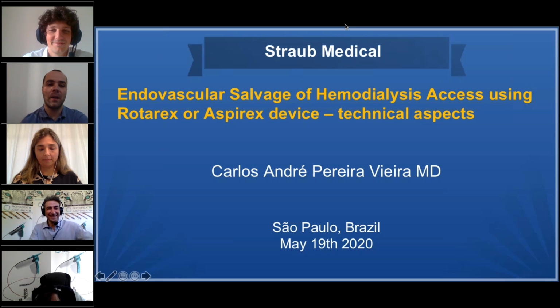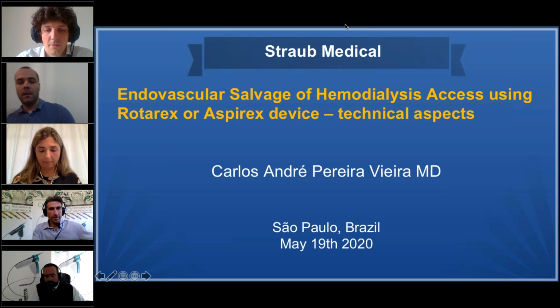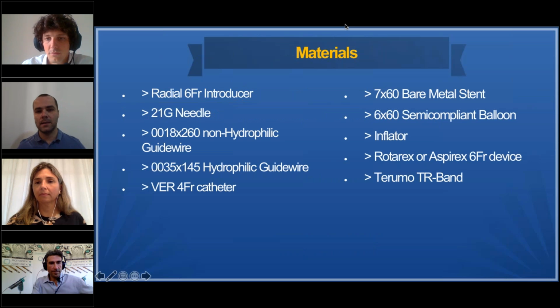Good morning, everybody. My name is Carlos Andre. I'm a vascular and endovascular surgeon. I'm talking from São Paulo, Brazil. The aim of today's presentation is talking about technical aspects of the endovascular salvage of hemodialysis access using Rotarex or Aspirex. A practical guide. The materials that we will need are a radial 6-French introducer.